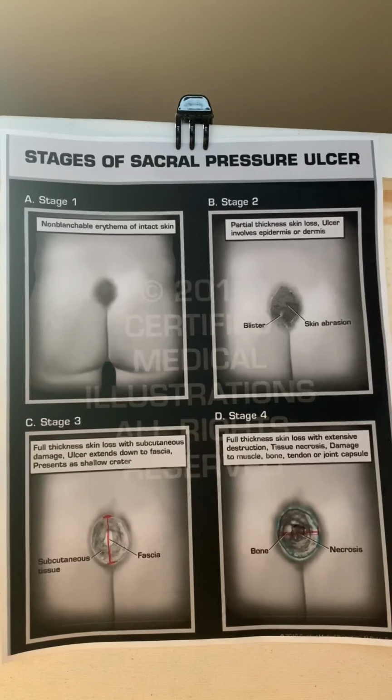This is more of a non-invasive way to measure the wounds, whereas some, I know they don't have nerve endings there, but some that still do, the poking and the prodding that they're doing, besides doing the wound dressing change, can be a little bit invasive and can be painful for the patient.